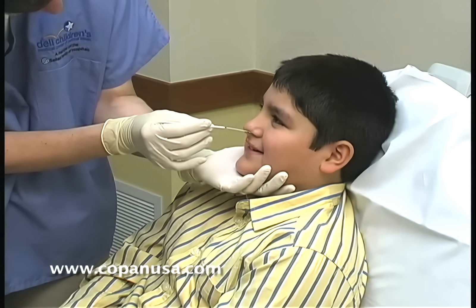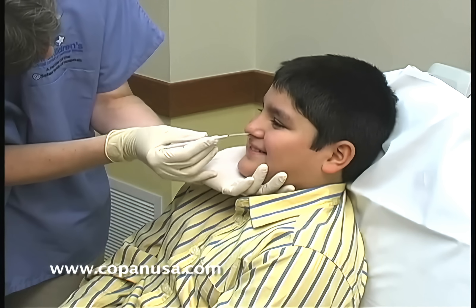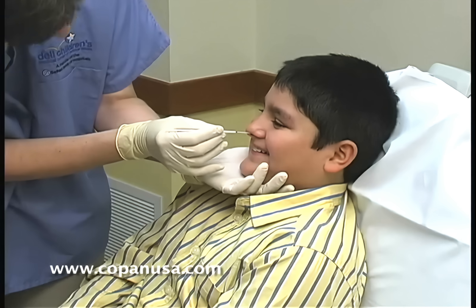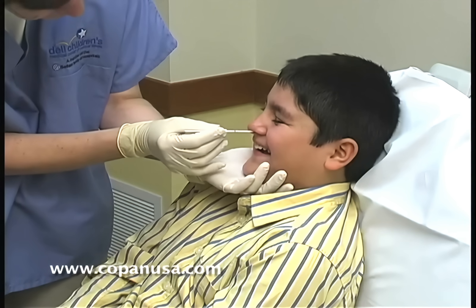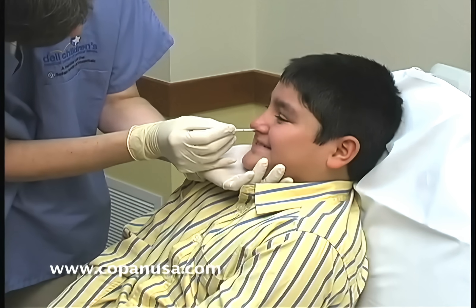We now have our marked swab — that's the length of insertion for the NP swab we're using on this young man based on his measurements. You gently go in, staying horizontal to the base of his nose. He says this is tickling because I can see him laughing, and you can see it's gently going in.